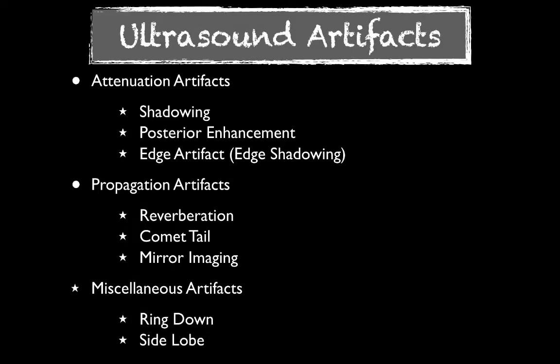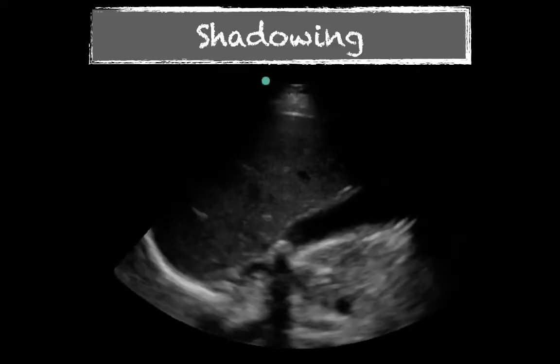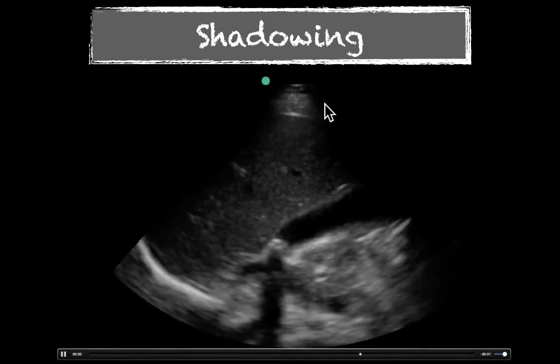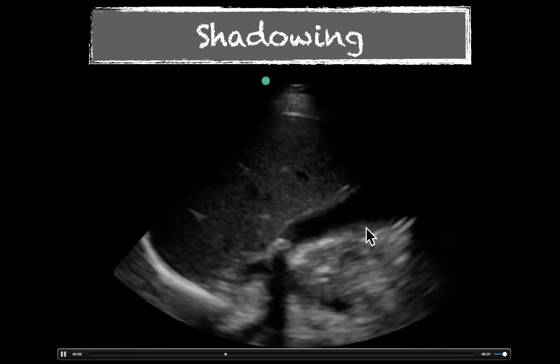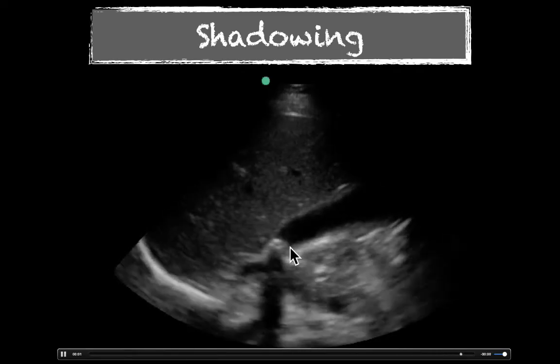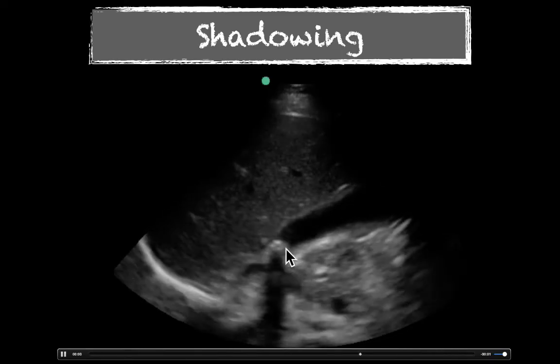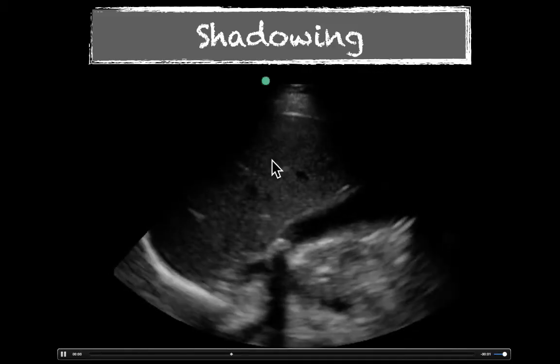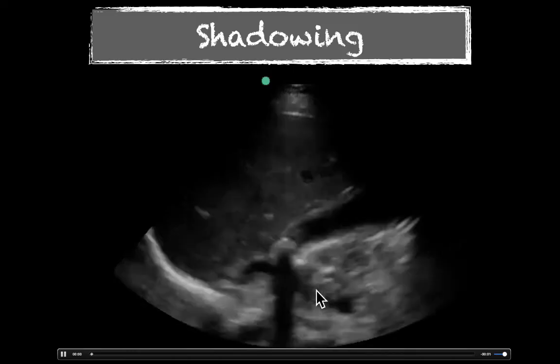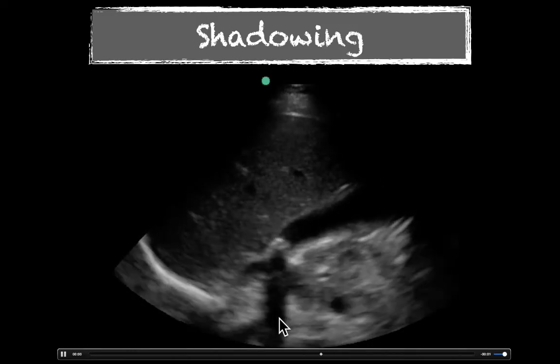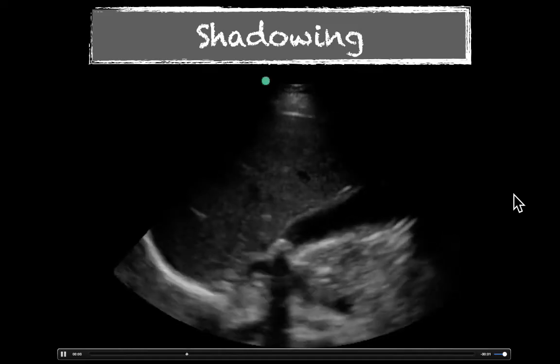When we talk about ultrasound artifacts, there are essentially attenuation artifacts, where there's loss of ultrasound waves, and propagation artifacts, and then some miscellaneous ones. One of our artifacts is shadowing. We see the liver, the gallbladder, and down at the neck there's a hyperechogenic structure, which is a gallstone. Because all the ultrasound waves come down and reflect back to the machine, we have loss of echoes behind that, creating this anechoic or black strip, which is shadowing.